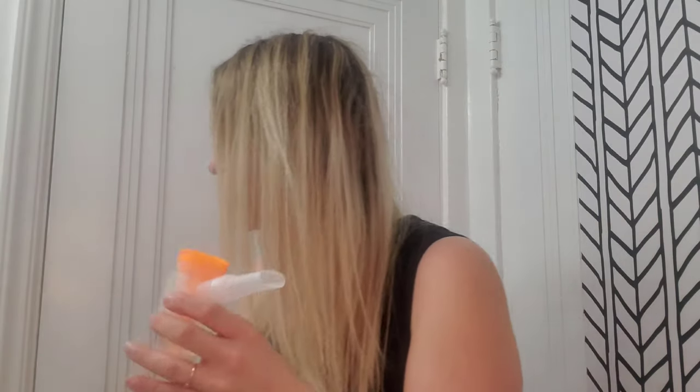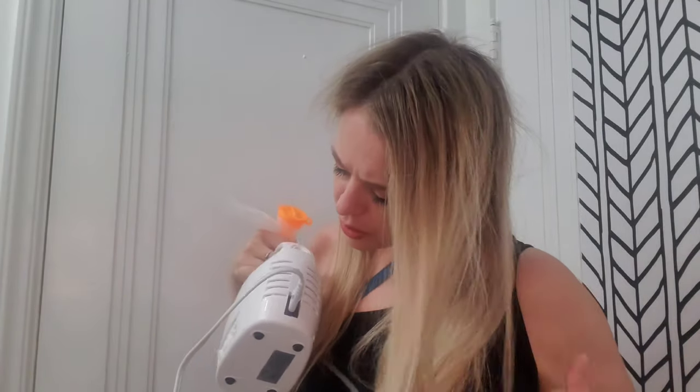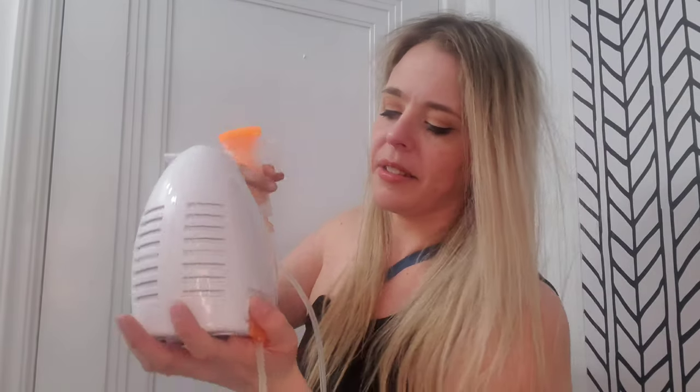To use, you simply fill it with your saline solution or your medicine, whatever you're using to nebulize. Then you take the cord and attach it to the base of the mouthpiece. Then come back and attach it to the side of the machine. It's a little hard to do one handed, but you attach it to the machine like so.